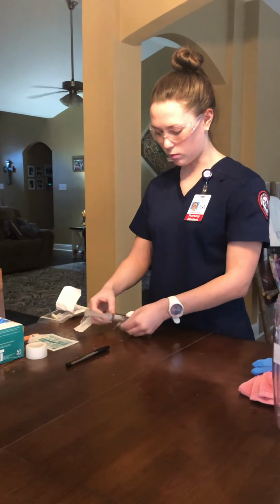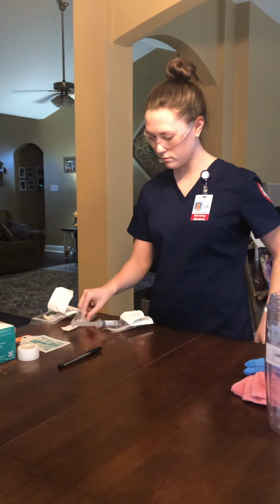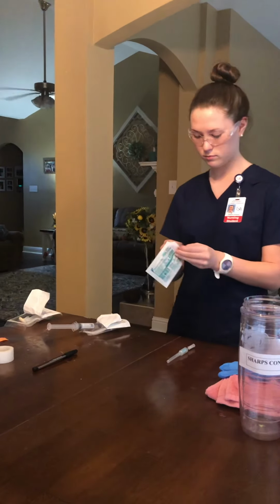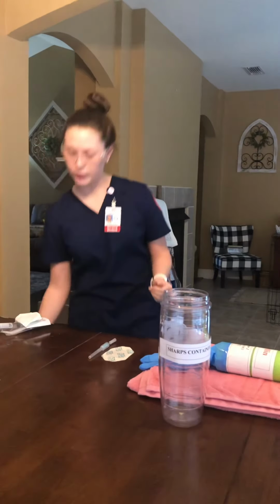So next thing I want to do is open up my over the needle catheter from the wrapper and my transparent dressing. And now I want to give three principles for selecting a vein. One is choosing the most distal site. Two is using the non-dominant arm if able. And three is avoiding areas of pain, infection, or wound.